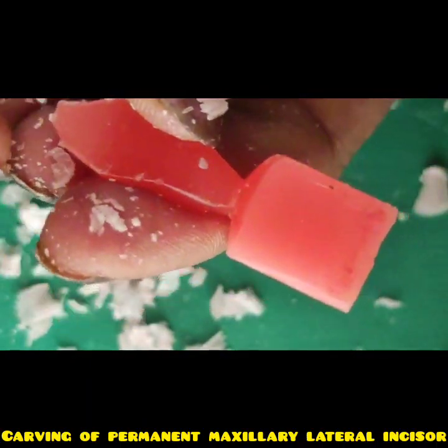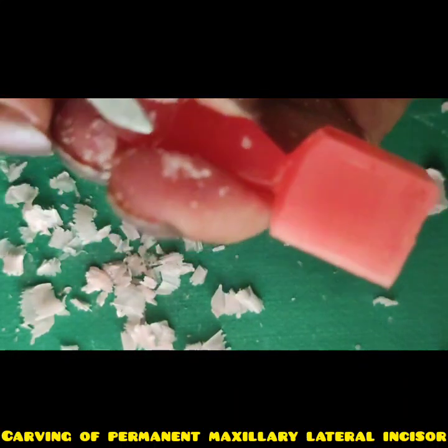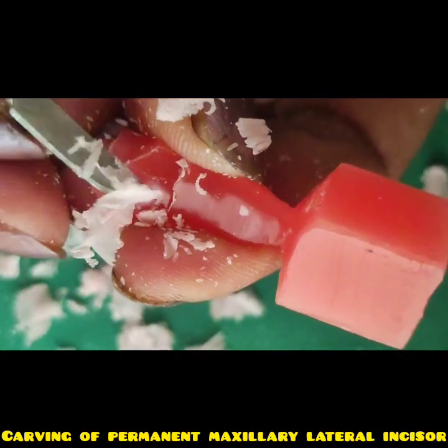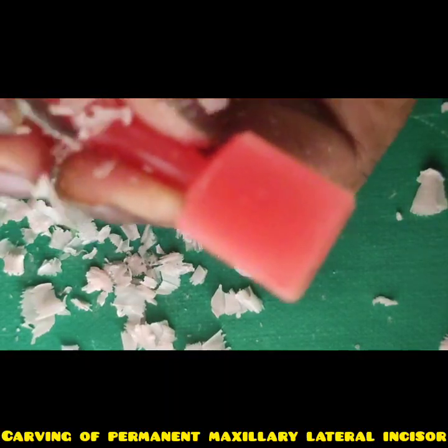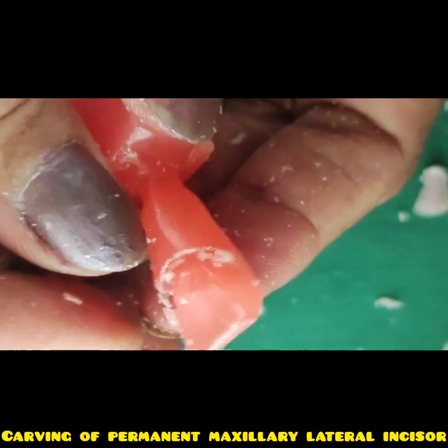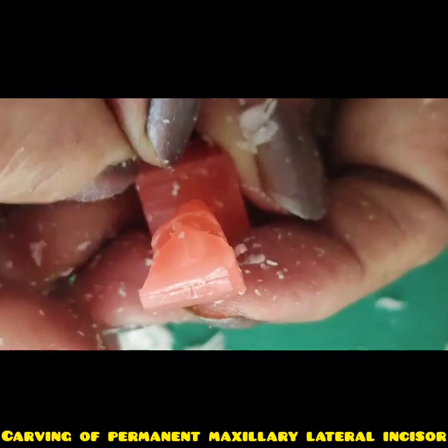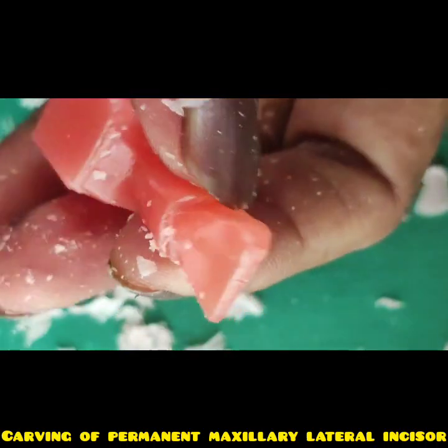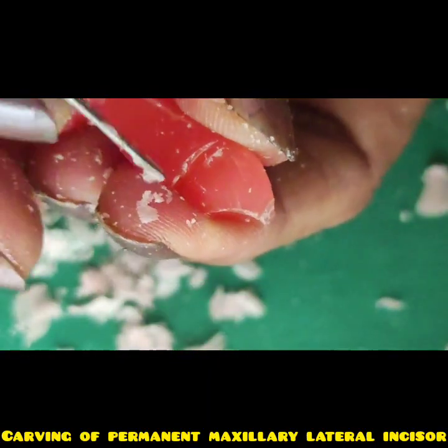Now the opposite side, reduction, like this, reduce, like this. So you can see our cingulum convergence from both sides is done, and we have got the extra step on the root wax, so I will reduce and merge it with the crown surface.